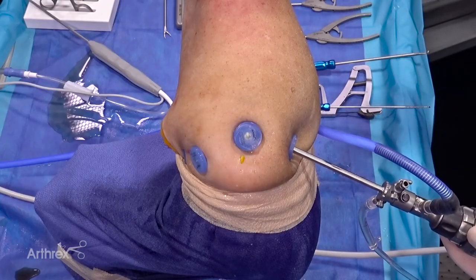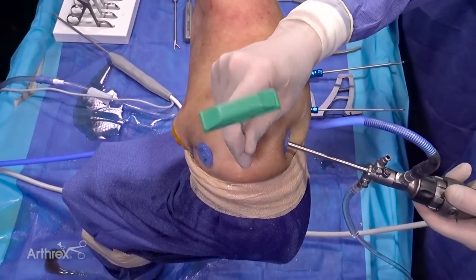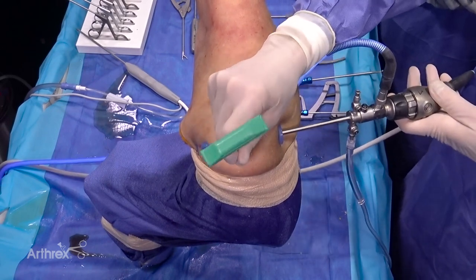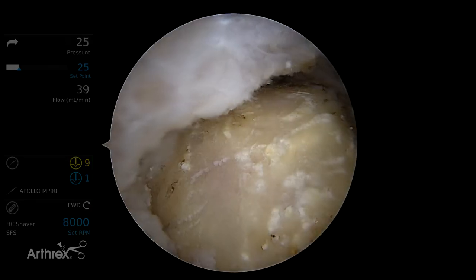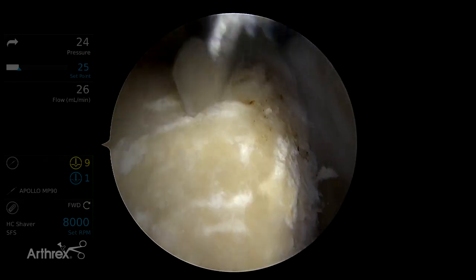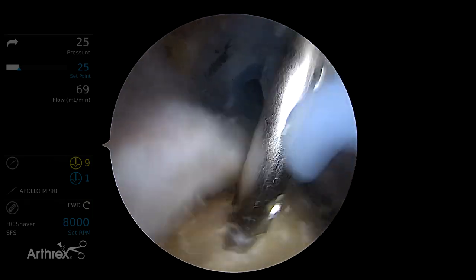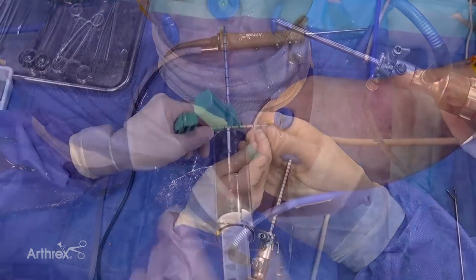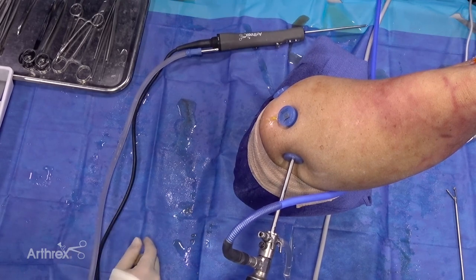We're going to first harvest some bone marrow concentrate. I've already made a portal just off the acromion — this will also be our portal for anchor placement for our medial row. We're going to come in here first with our Jamshidi needle, right into the proximal humerus for harvest of our BMC. There's our humerus right here, in the lateral extent of the footprint so we can come down the shaft. Here's a full 30cc syringe, and we get two of these. Next we're going to proceed with our cuff repair; we've prepared the footprint and we're getting our BMC spun in the Angel system.